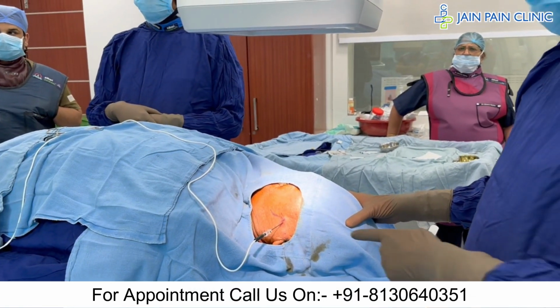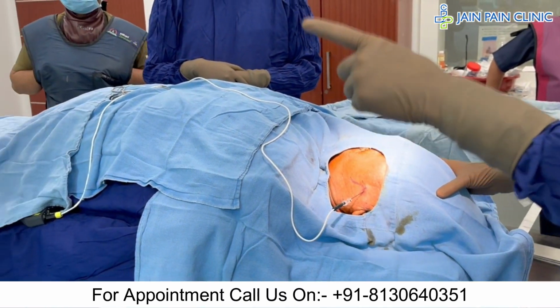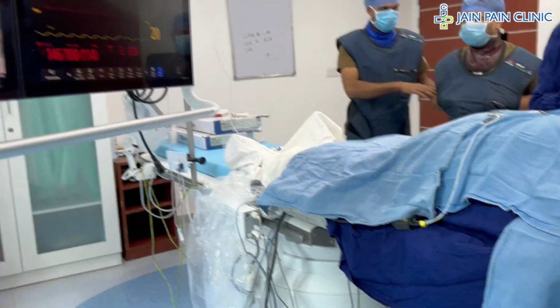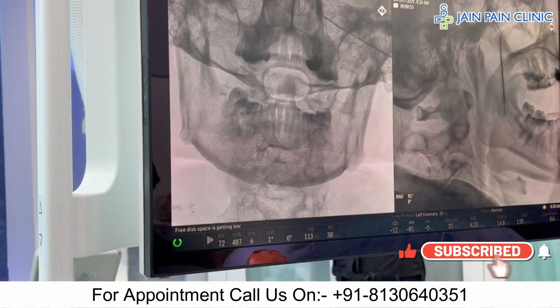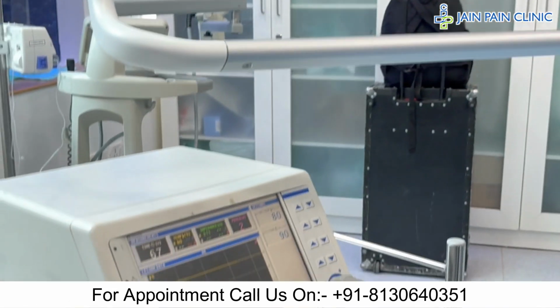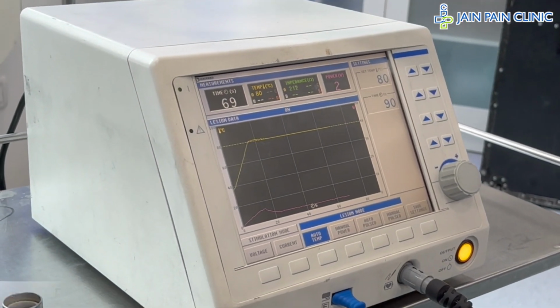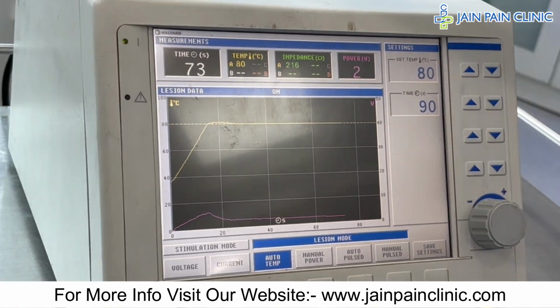Now we are doing the RFA. So the 10-5 cannula and needle are perfectly placed. Stimulation is perfectly achieved, and you can see both AP and lateral view, perfect views. And then this is the 80-90. We will do 4 lesions at 80 degrees centigrade for 90 seconds.